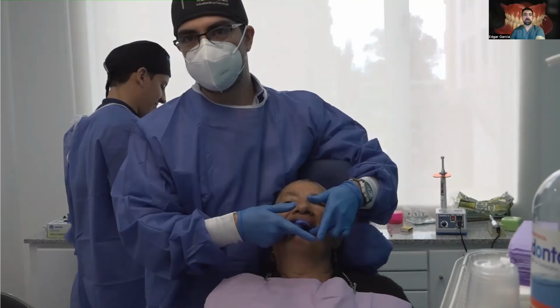Exactly. Okay. But at first, I do this because we need a space for the border molding. Right. Okay. So when I have this space, I'm not going to have retention. So the first step for me is to do the border molding. It's not with the mouth closed. Right. Okay. But after this, I cut the excess of the heavy material. And I do the DVO adjustment with the wax, how much of the bite rim is going to show, the midline, everything that we know. Okay.